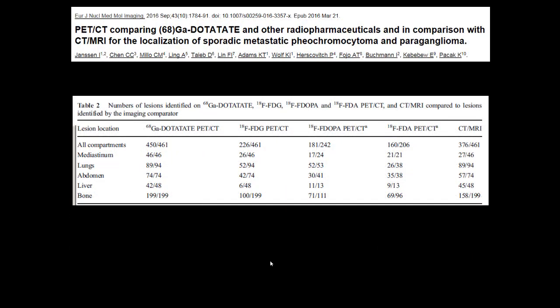Again, we have a big neuroendocrine tumor group. So for us, the ability to do, for example, a gallium dotatate exam and take advantage of that for looking at neuroendocrine lesions using PET MR has been really valuable.